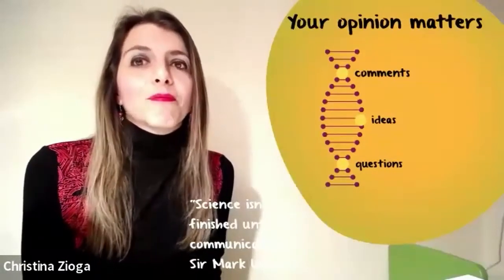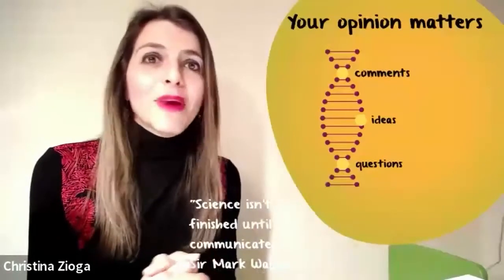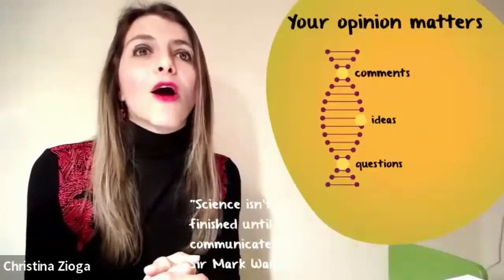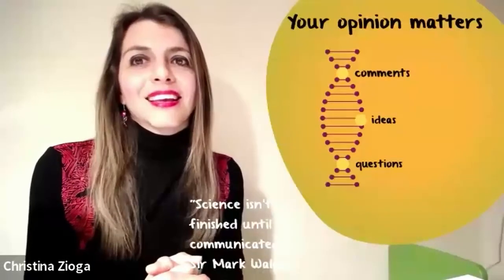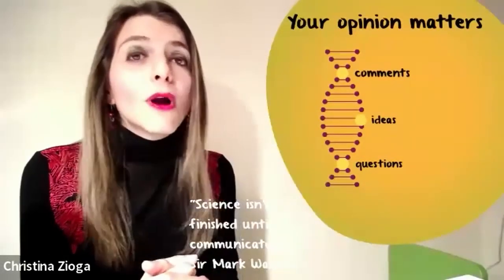Now it's the time to make it our algorithm. So the idea is not mine anymore, but ours, our big cytology family. Let's see how we can make it our algorithm. We can work on this together.